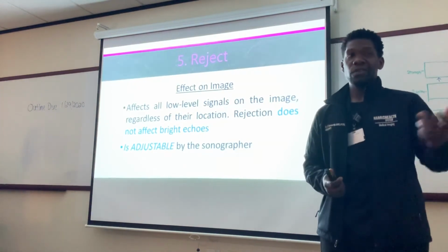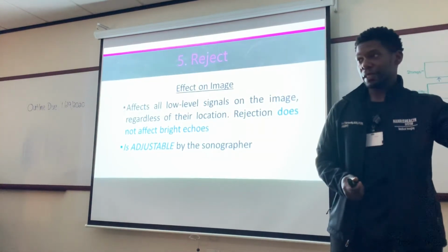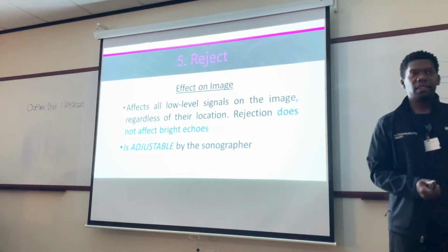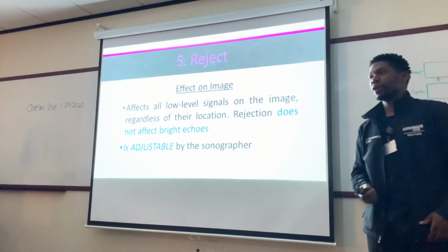Okay? Because when you have a bad machine, you have to optimize the image. Like when you're using the Toby, it's limited, right? You guys don't even use it anymore because y'all just want to use iE33s, right? So that's just what I mean. Those new machines aren't always available depending on where you go.